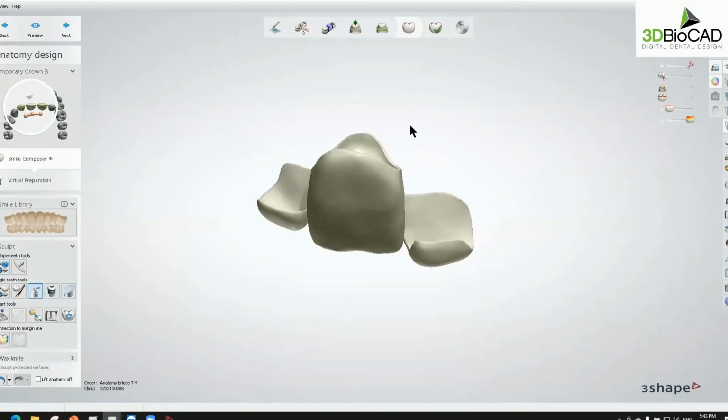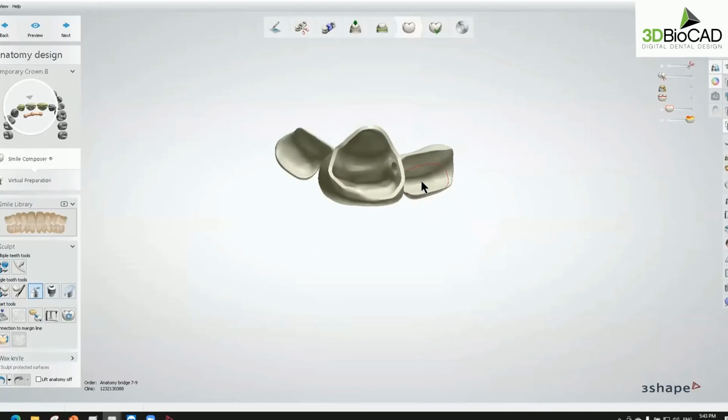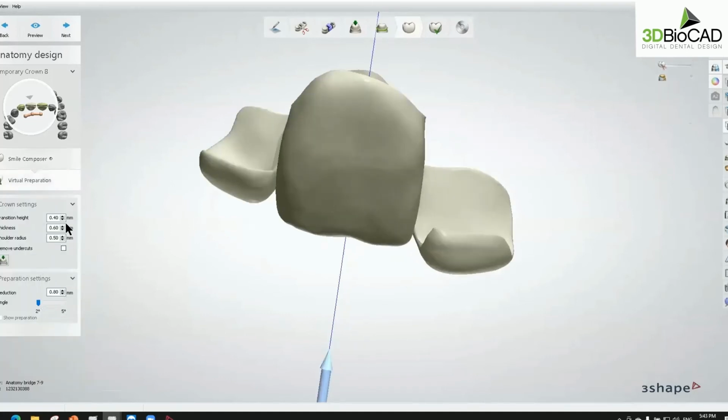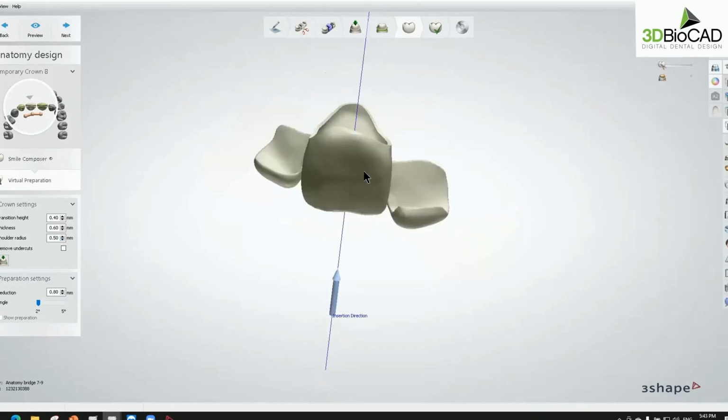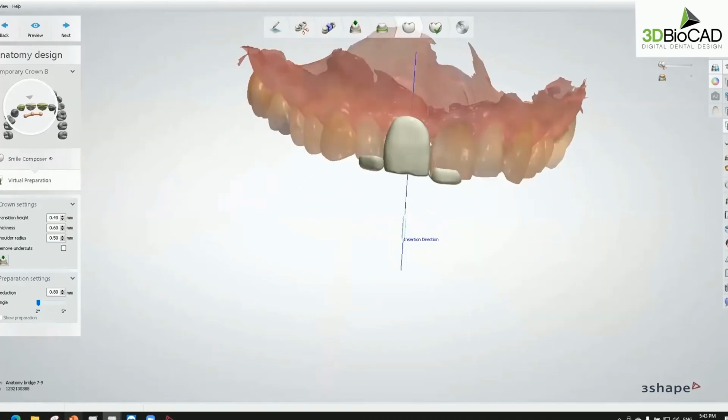But of course, we have to keep the minimum thickness to avoiding breaking the PMMA. But for implant restoration, if you want to make a little thicker than normal crown shell, of course, we can set it up ourselves in the design system. So simply, we have all the tools and primary offset settings in the designing period. So for shell and also for wing, we could make with a dental system from 3Shape, okay? Let me go back my presentation.